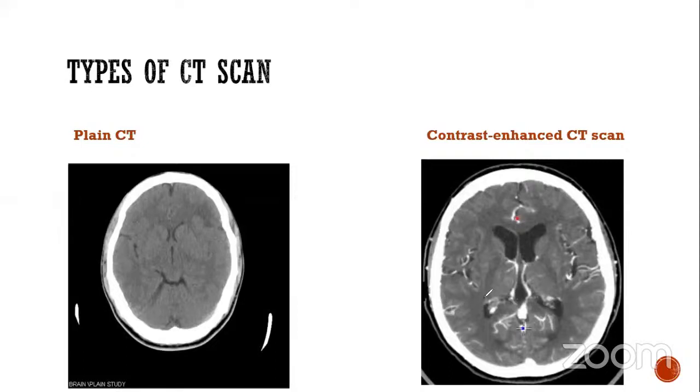In contrast enhanced CT, it is usual to inspect the plain CT first and, if necessary, to proceed to the IV injection. Contrast enhanced CT is useful for many reasons: tumors with abnormal vasculature are enhanced and better visualized with contrast enhancement. If there is an aneurysm or angioma, they are also enhanced. It also helps to differentiate between the gray and white matter in cases of brain edema, etc.